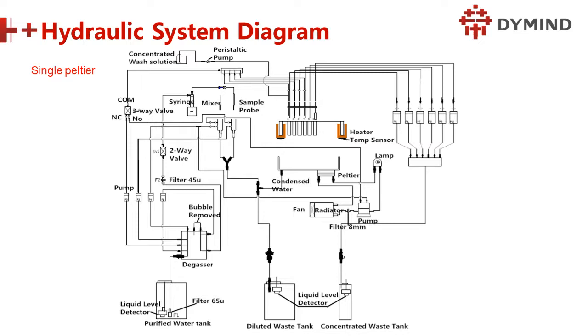Yes, yes. They get damaged very easily just because the liquid is different. Here is only pure water, but this is a concentrated waste. So that's why the service life is lower, and we should prepare. If I were a field engineer, I would bring this pump, because it is very easy to get broken.